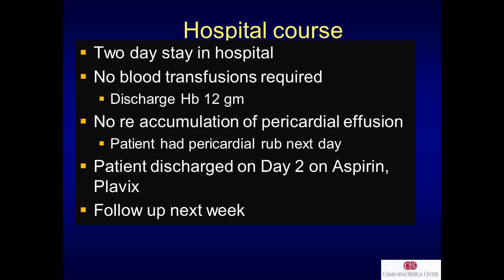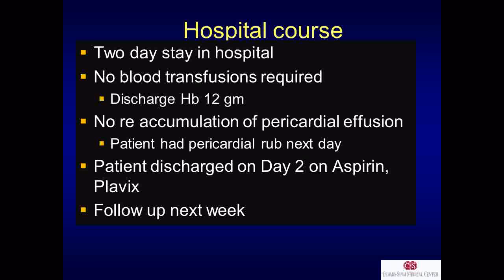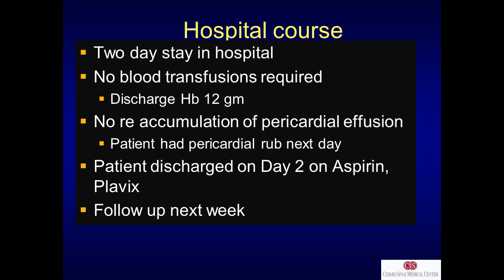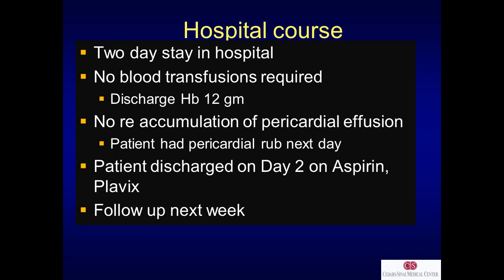But it's a good thing to know that a covered stent is very helpful. The reason we have these covered stents is because we do coarctation of aortas for babies. When you do a coarctation of aorta, you can actually tear the aorta. So you should always have a covered stent as your backup. Very nice. Thank you. Good.